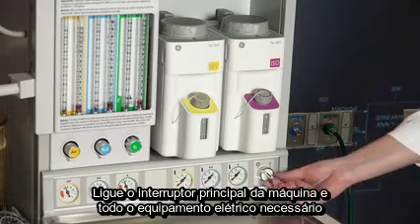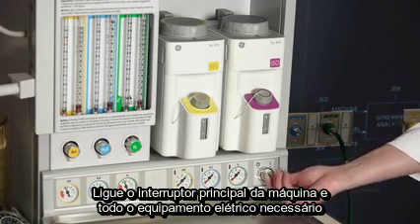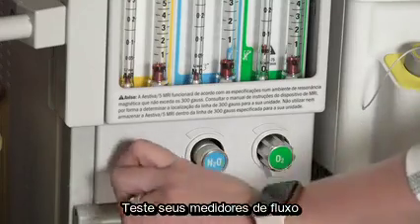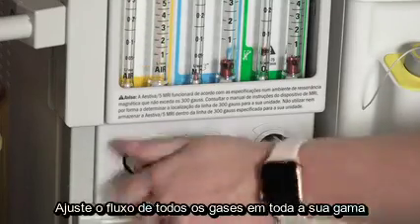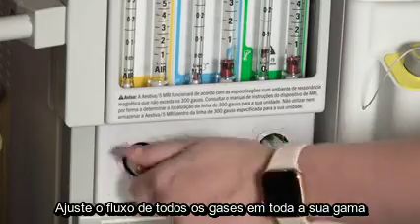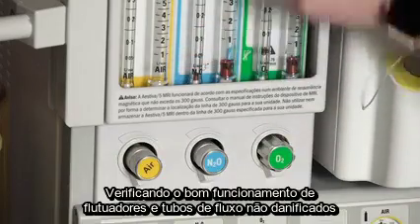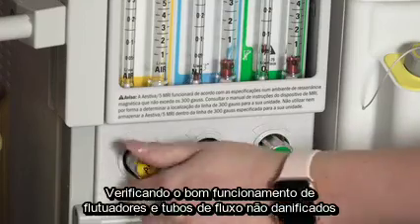Turn on the machine master switch and all necessary electrical equipment. Test your flow meters. Adjust the flow of all gases through their full range, checking for smooth operation of floats and undamaged flow tubes.